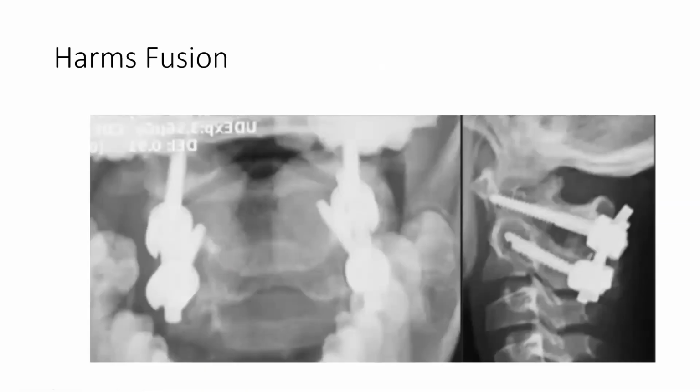Okay, this is a Harms fusion. So once again, a C1 lateral mass screw and a C2 pedicle screw. And these pedicle screws should be a bit more convergent. If you're going to go straight, you'll hit the vertebral artery out there, but that's your Harms fusion. And then you tend to want to lay your bone graft, decorticate the back arch of C1 and the lamina of C2, and you want to put strips of the patient's iliac crest in there. You don't want bone dust because it just disappears in the soft tissue. You want to put strips of crest in.